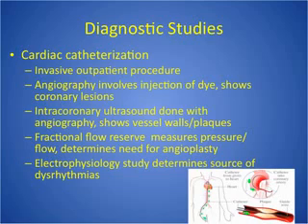On the right side, they would go up to the vena cava, to the right atrium, to the right ventricle, and then up into the pulmonary artery. They would also be able to look at the left side of the heart. For the left side of the heart, they use the femoral or the brachial artery. Again, we're not seeing the arms used as much, but we may start to. I saw a new study on that. And then they go in the aorta and look into the left ventricle if they're looking at the left side of the heart. So it tells us lots of things.